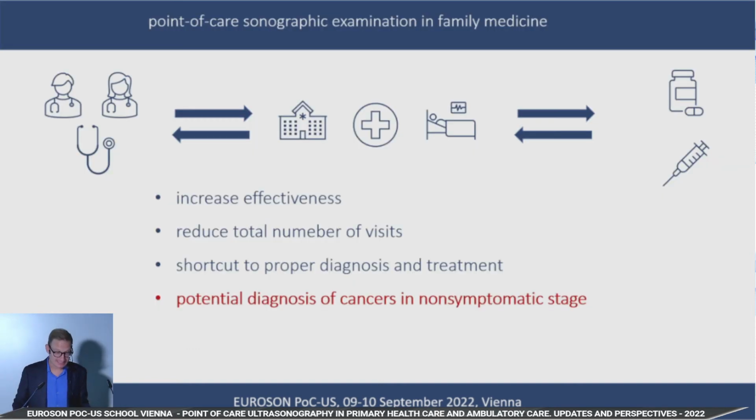And getting to the end of this lecture, point of care sonographic examination, symptom-focused sonography examination will increase our effectiveness, reduce the total number of visits, because during one visit we can solve many problems. It will give us a shortcut to proper diagnosis, and maybe it will help us to deal with diagnosis of early stage of cancer in a non-symptomatic stage. Thank you very much.